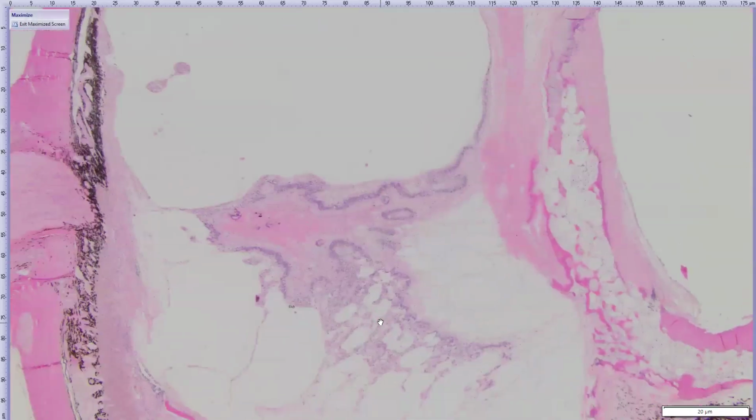Moving back, there's also some lesions that potentially we could attribute to trauma. So we do have a lens capsule rupture and a hypermature cataract. We also have retinal detachment and atrophy, as well as kind of this collagenous tissue that's being laid down. In animals that already have a blind eye, they are going to be less able to protect it. So it's possible this cat in the neonatal phase developed a blind eye, then at some point in life it bopped it and caused concurrent traumatic lesions.